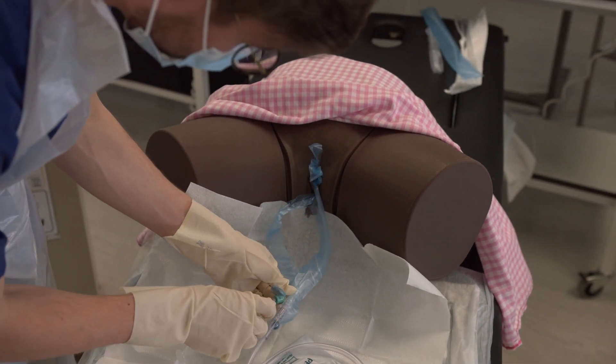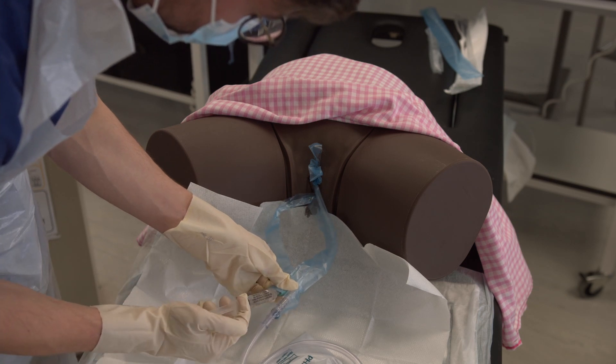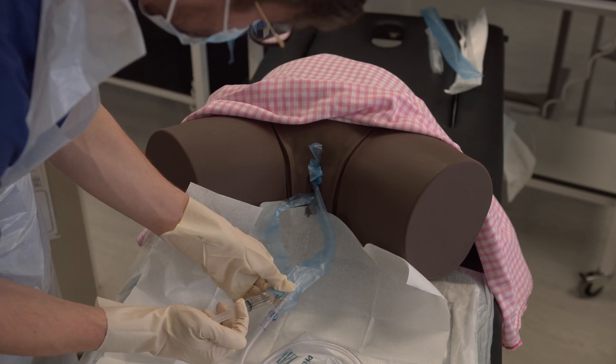Inflate the balloon by connecting the water syringe to the green end of the catheter and pushing through all 10 millilitres of water.